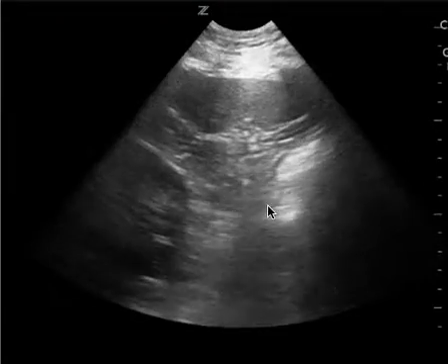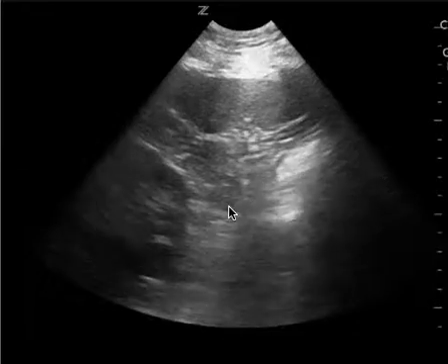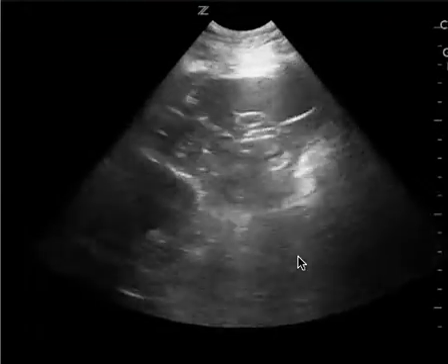This is the left upper quadrant. The probe is backwards — this is the spleen and this is the kidney. You want to reverse it. The indicator, which is the Z here, is pointing towards the patient's feet. You want to be pointing towards the patient's head.